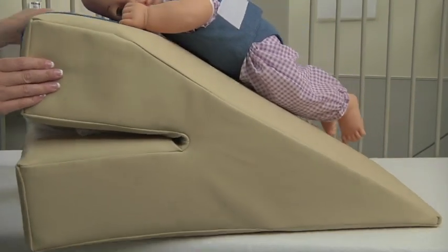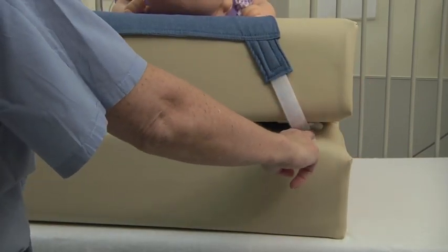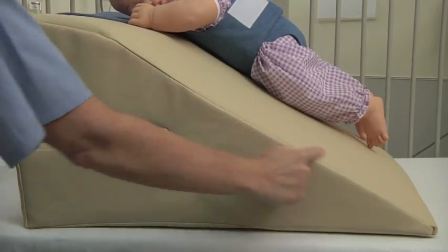The sling attaches to the wedge in between the slits, and it raises and lowers up and down the incline of the wedge.